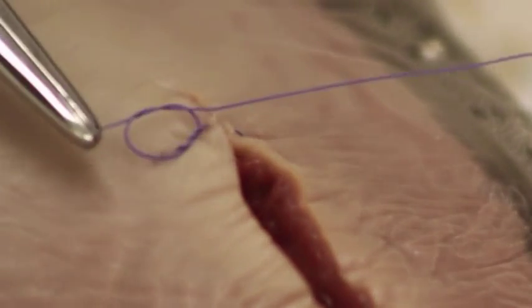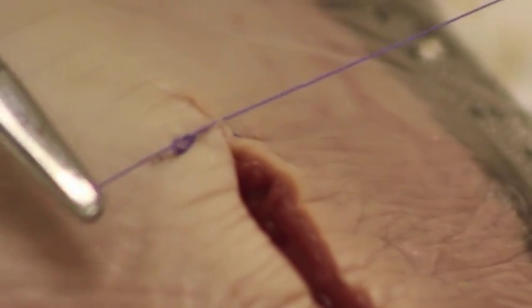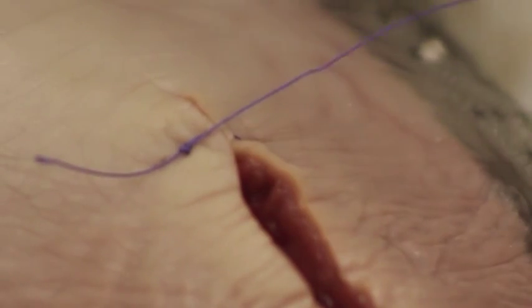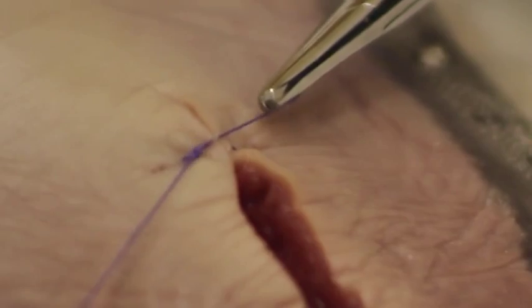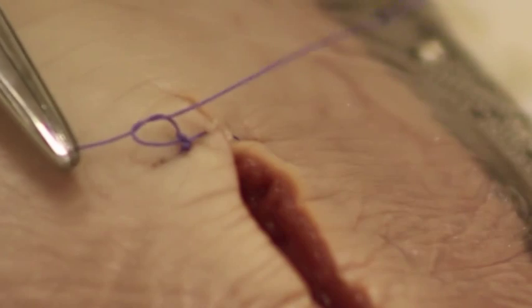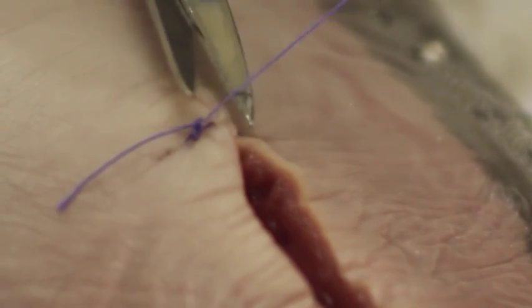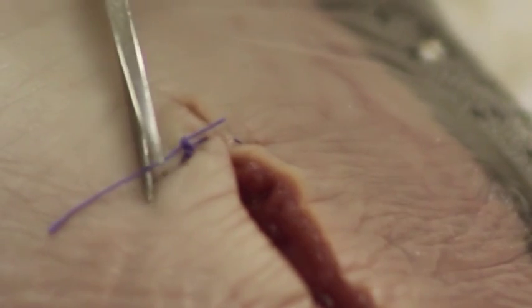Pull the second time and you see how I come down flat, put it in the middle, wrap it once. Come down flat, wrap it once again, and I'm gonna come down flat as you can see. Cut.